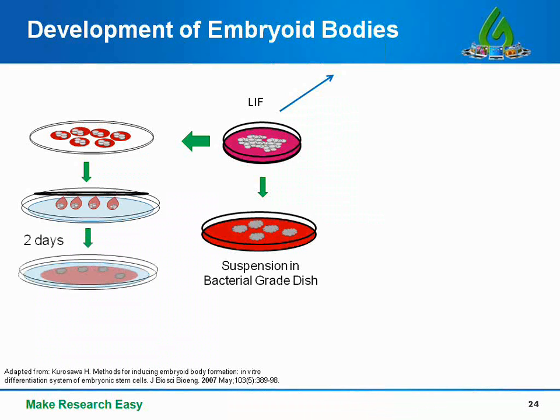Now in the petri dish, you should have PBS. This will prevent the embryoid bodies from drying out. Following this, you'll get homogeneous sized embryoid bodies that can then be transferred to the culture dish suspension and cultured for an additional 3 to 5 days.